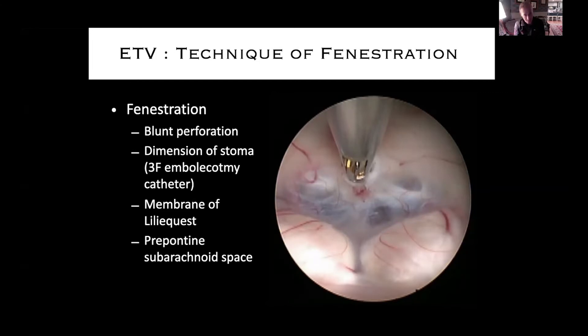It's got to be a very blunt perforation. You'll see on every video it's kind of like a little push and then a pop through — gentle tension and then the floor will break through. I use a 3 French embolectomy catheter; that seems to be the size that works best. It fits through the scope really nicely and dilates up to a beautiful dimension. Then you're going to see lots of mention of the membrane of Liliequist, the importance of that in creating a patent ETV, and then exploration of the pre-pontine subarachnoid space.